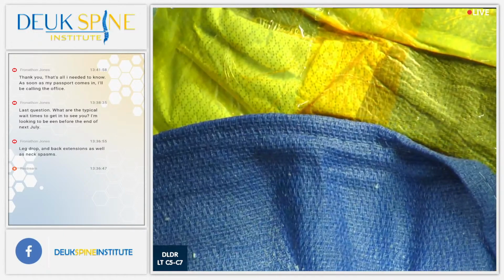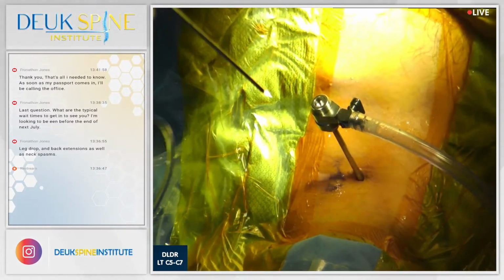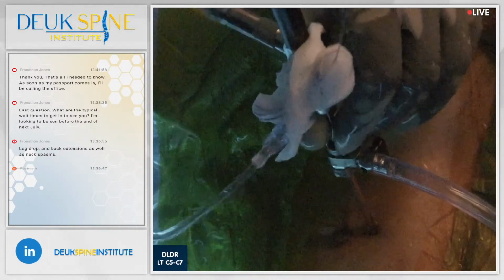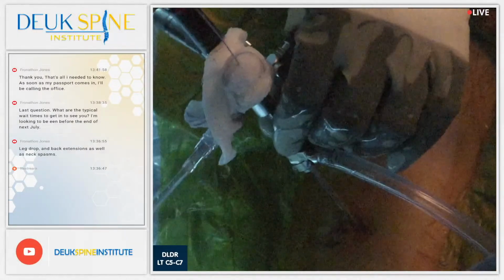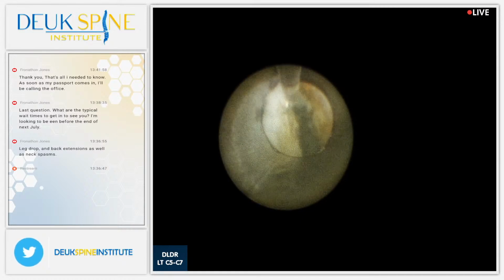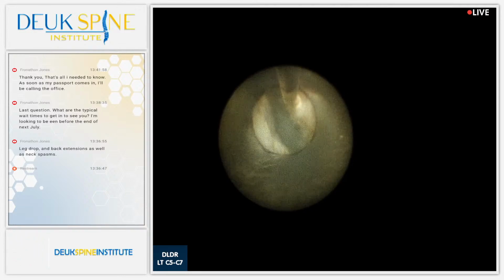These herniations look big on the scope, but they're really not that big. The problem is there's lots of them. A herniation is actually like 30 pieces about that big. When you add them all up, it's like having a bag of marbles. One marble in the bag isn't so bad, but when you have 30 marbles, that bag gets pretty heavy, pretty dense, pretty full. So the bag would be the herniation, and the marbles would be pieces of herniation that make up the big herniation. Hope that makes sense. All right, we're pretty much done with this level.